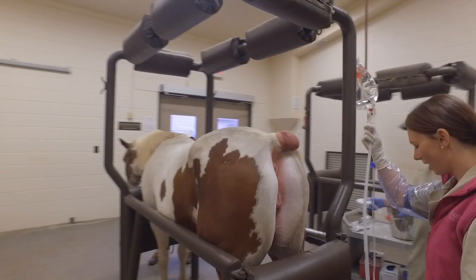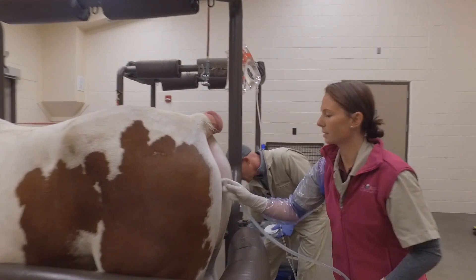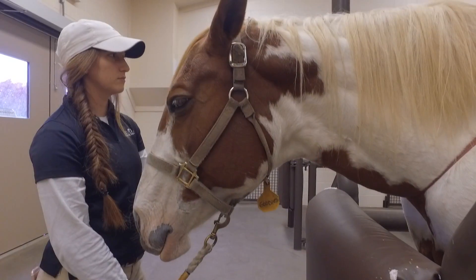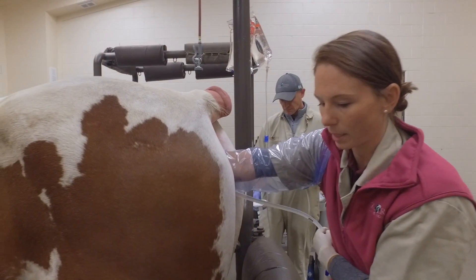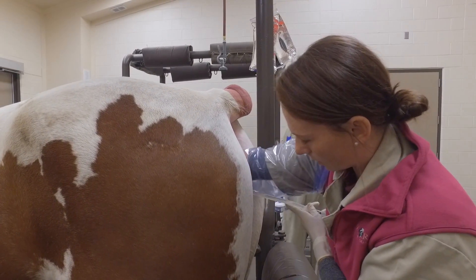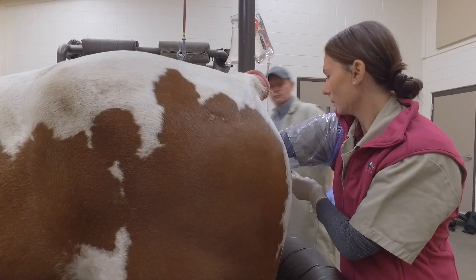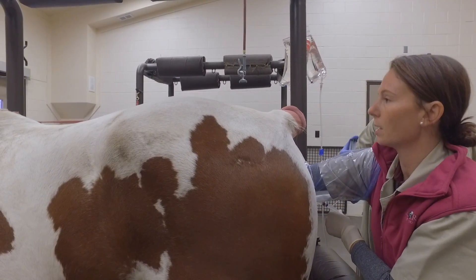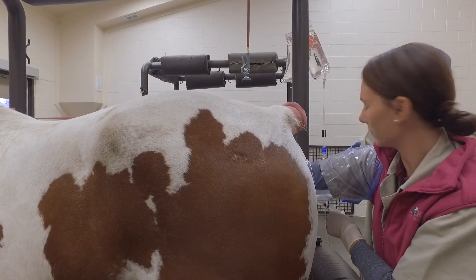Dr. Scoggins has the embryo dish in our filter, and I'll go ahead and place this catheter through the vagina, into the cervix, and into the uterus. While I'm doing this, I'm feeling with my finger at the external os of the cervix, making sure that it's nice and tight, as I place the catheter through it and into the uterus. Dr. Scoggins is going to place some fluid and air into the cuff so that it blows up and the catheter will stay in the uterus and won't come out while we're performing the embryo flush.